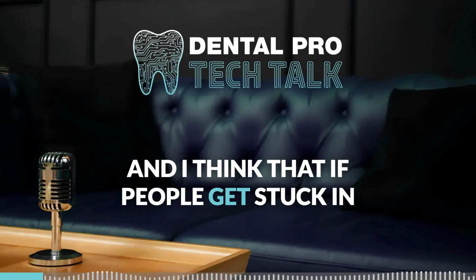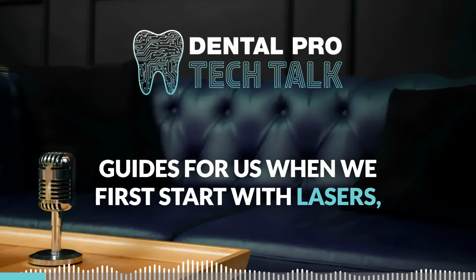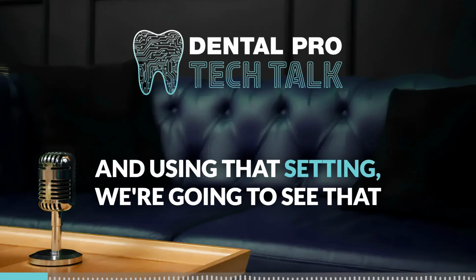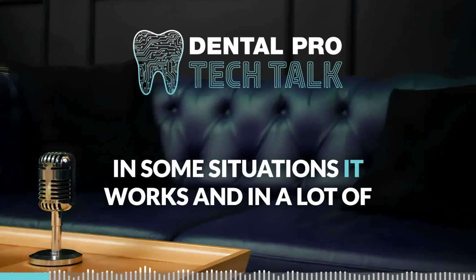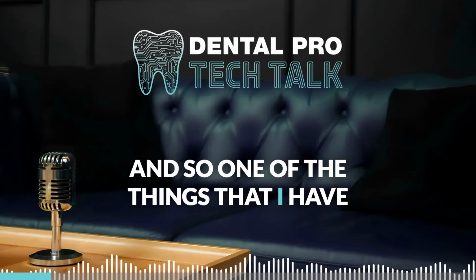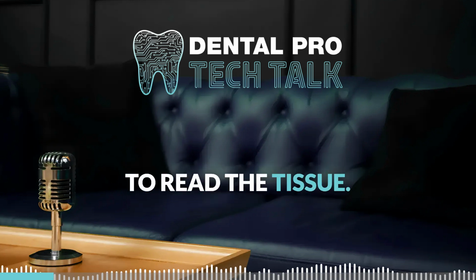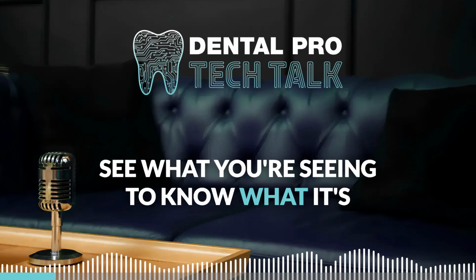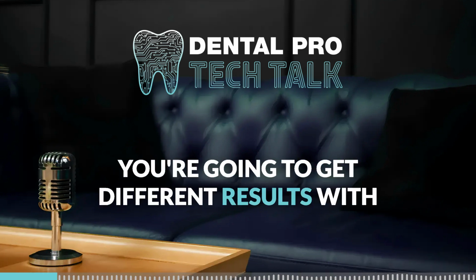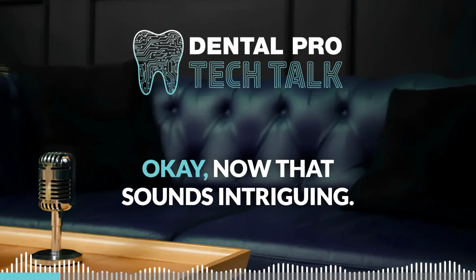And I think that if people get stuck in just doing the presets, which are awesome guides for us when we first start with lasers, but if we just get stuck in pushing a button and using that setting, we're going to see that in some situations it works, and in a lot of situations it doesn't. One of the things that I have really tried to focus on with teaching my courses is to teach my students how to read the tissue, see what you're seeing, to know what it's doing. Because if you have one setting, you're going to get different results with different patients, especially in different chromophores of tissue.